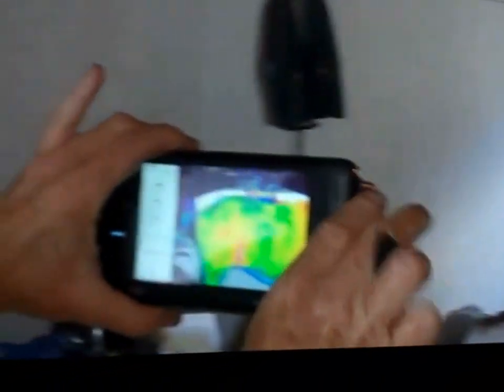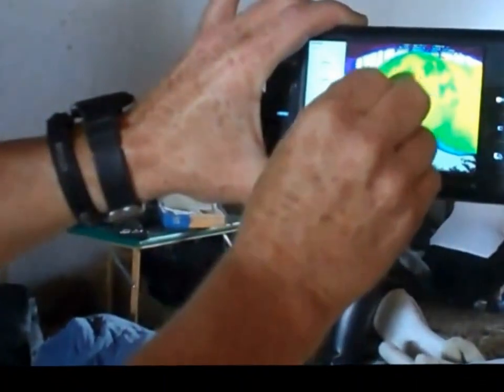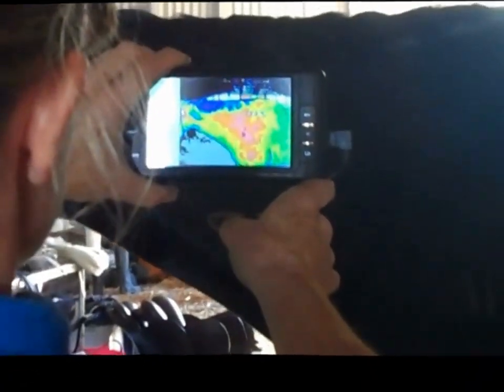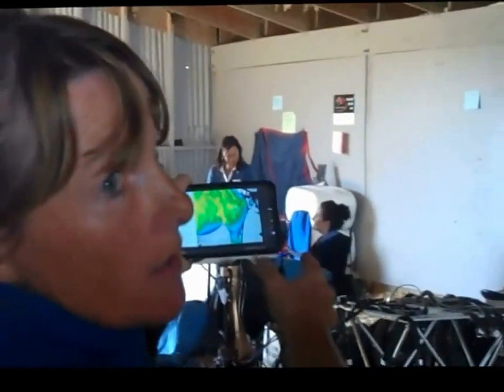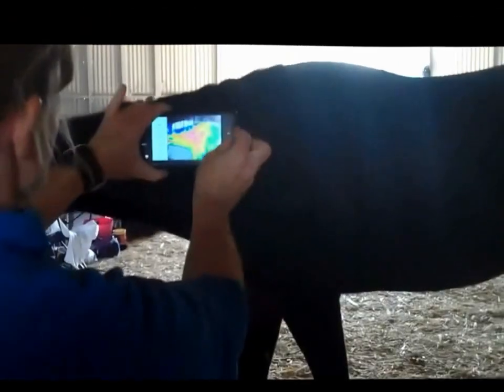When we start to look at the body we can see his neck and the shoulder area. Looking at his height we can see the exact spots that he's soring through here. Coming up to the shoulder area, there's a lot more heat in his shoulders compared to his legs, and this side is probably slightly different. Usually I put the mane out of the way. Those are his hindquarters — there are some spots there. In general, the shoulders are always hotter than the hindquarters because of how the horse puts its weight. There's also a lot of heat through his wither and all through here.